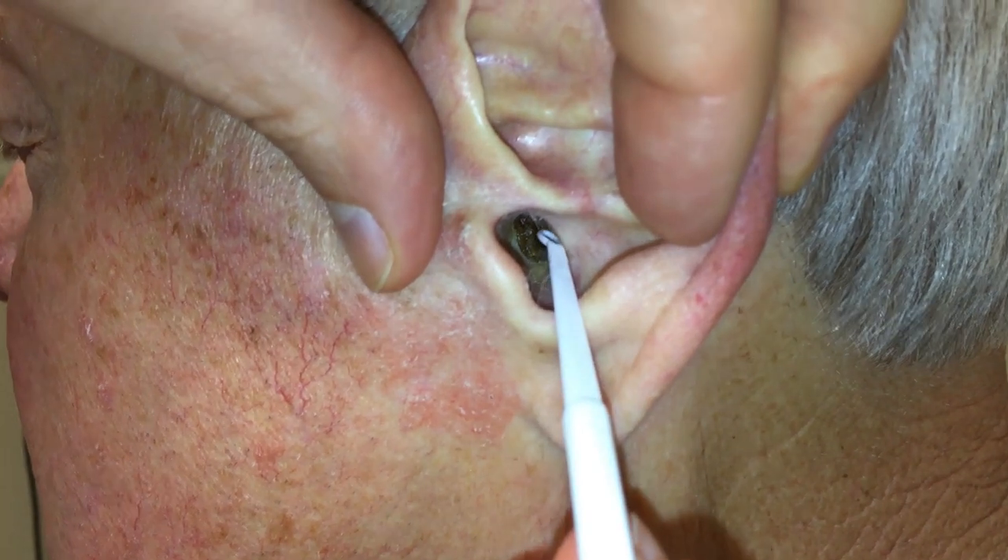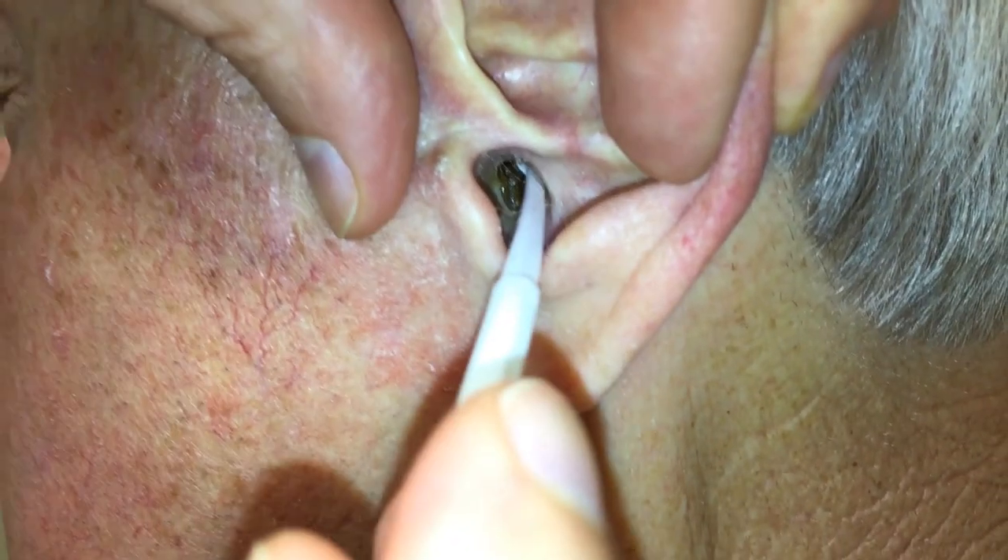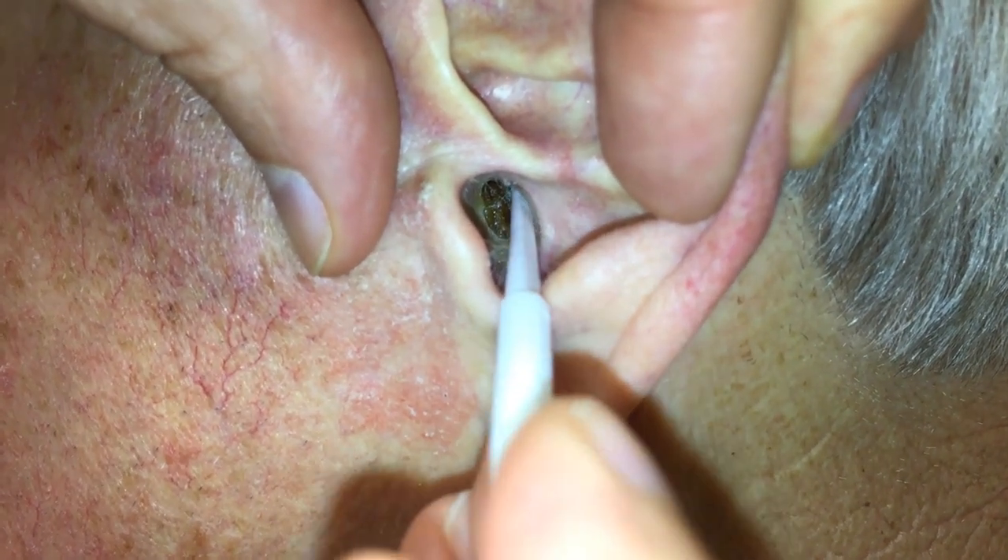We're going to try this flexible curette made by a company called Bionics — we may have some equipment from them coming soon. Up there is where I thought I could just break through, but when I pushed the swab in, the end of the stick dug into some really hard wax, and I realized I'm going to have to get a curette for this.